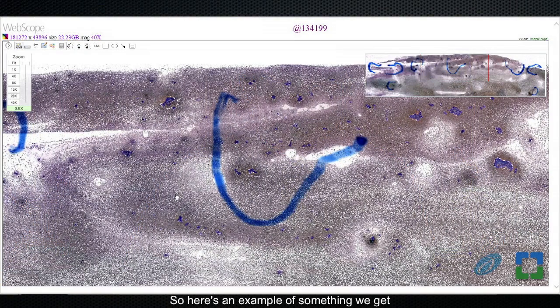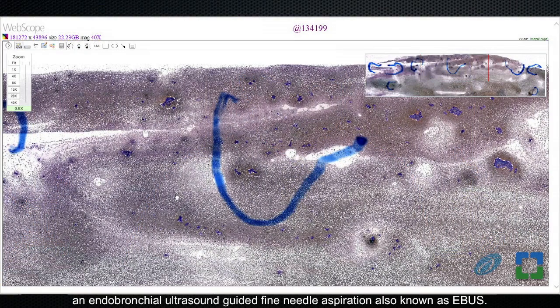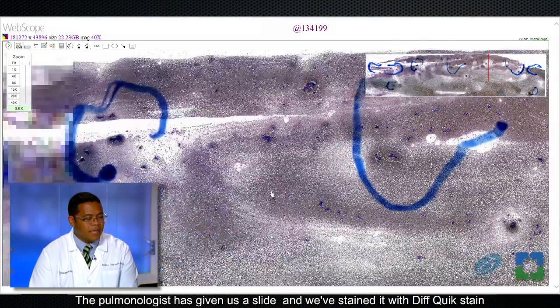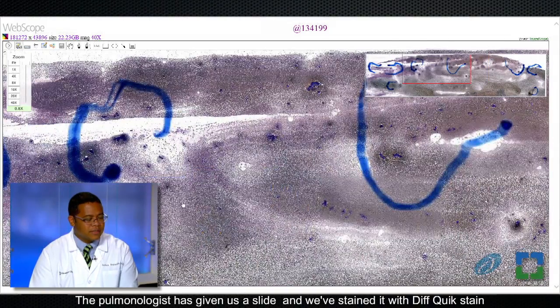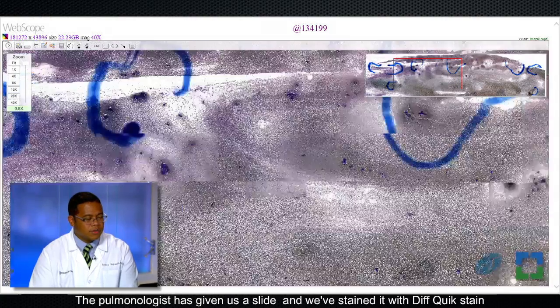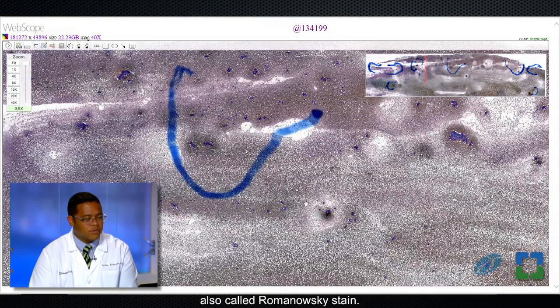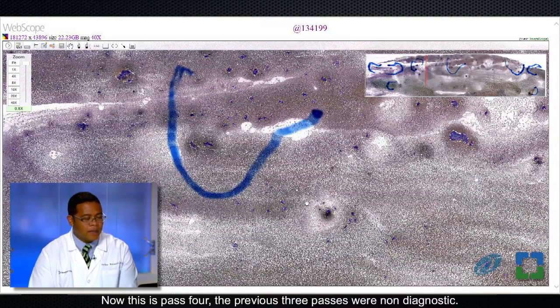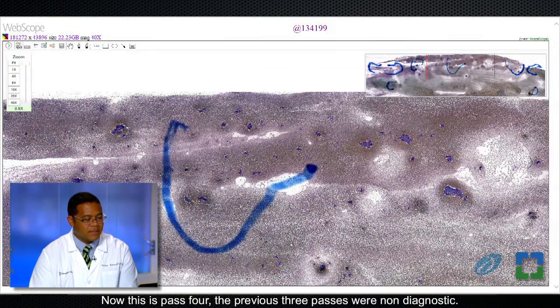Here's an example of something we get at Endobronchial Ultrasound Guided Fine Needle Aspiration, also known as EBUS. The pulmonologist has given us a slide, and we've stained it with Difquik stain, also called Romanowski stain. Now this is pass four. The previous three passes were non-diagnostic.